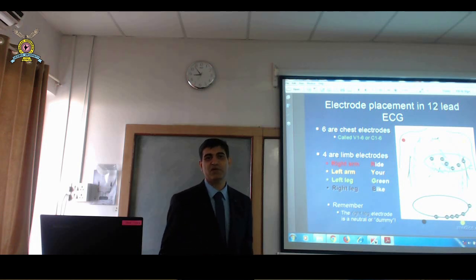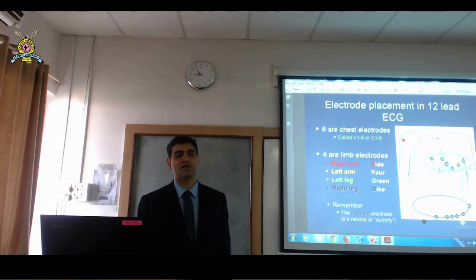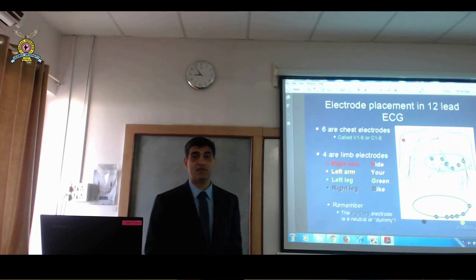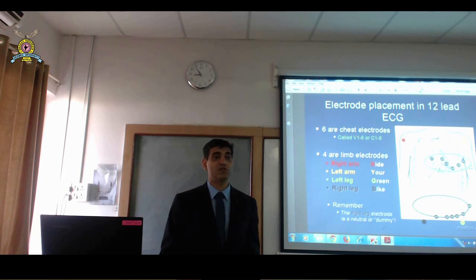Do I ever do that? I don't ever have to do that because I've got a cath lab. So I don't care whether it is RV infarct or not clinically. In the old times when I was an MD student, we would do that for academic interest. We did a V4R and there's the ST elevation. How important is that? That's because if you have RV infarct, you get shock JVP syndrome. Have you heard of shock JVP syndrome?